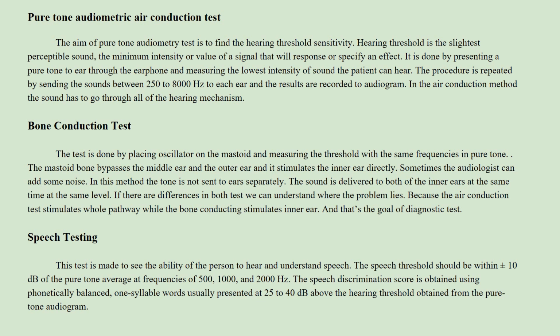If there are differences in both tests, we can understand where the problem lies, because the air conduction test stimulates the whole pathway, while bone conduction stimulates the inner ear. And that's the goal of the diagnostic test. So if there is something different in the bone conduction test, we understand that the problem lies in the inner ear. Lastly, speech testing.